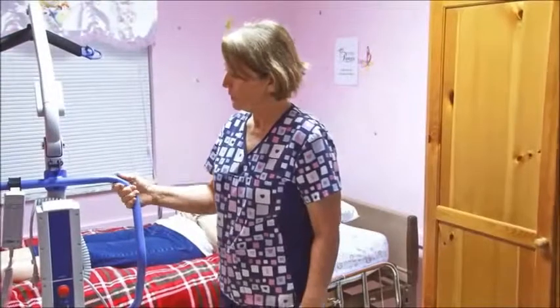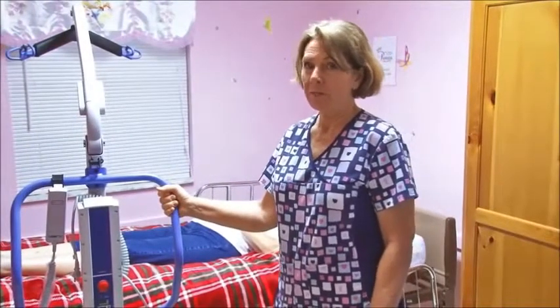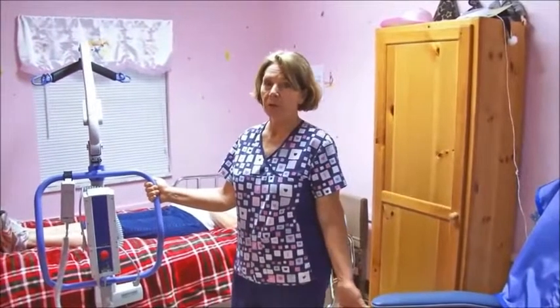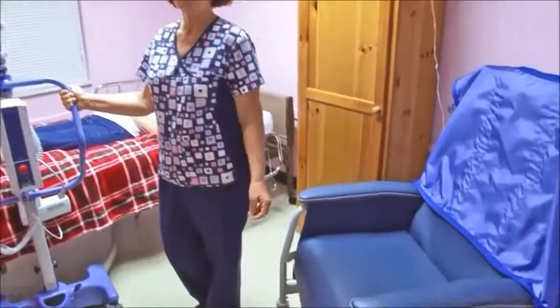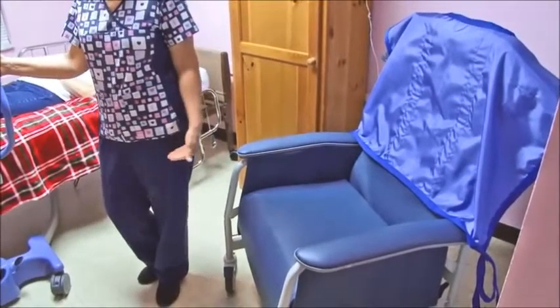This is the Hoyer lift. This is going to assist us with getting the patient out of the bed and into the bed onto either a jerry chair, a shower chair, or a wheelchair. The wheelchair or the jerry chair will be placed in the proper position for moving the resident.